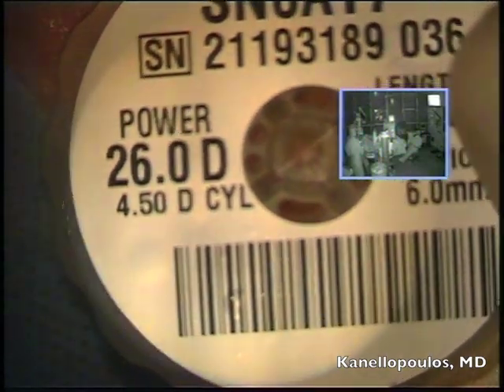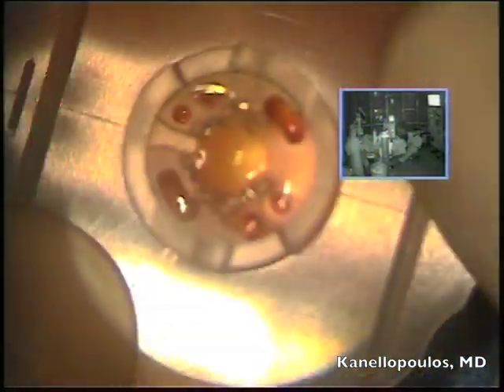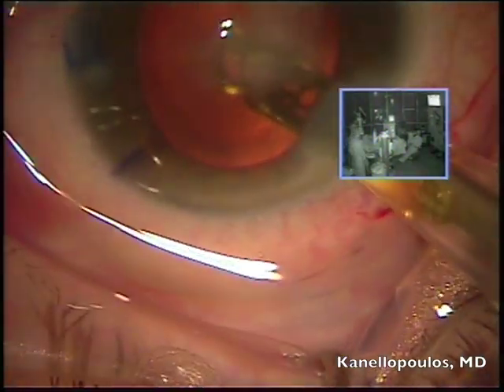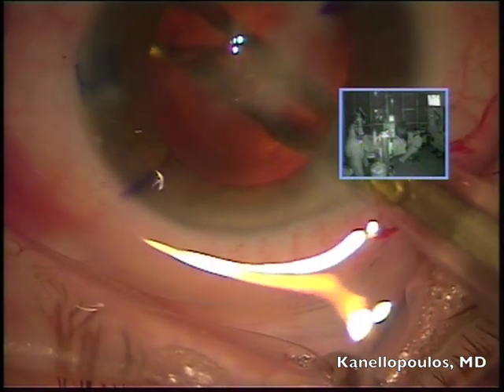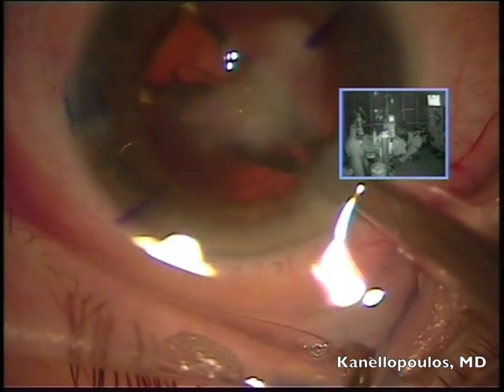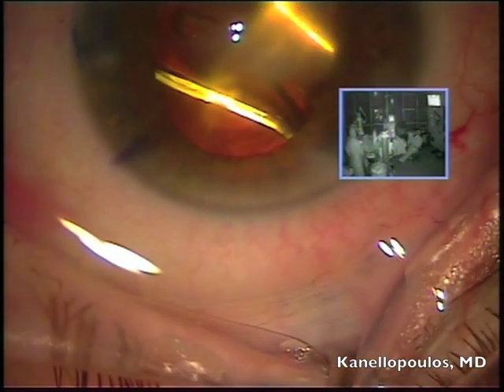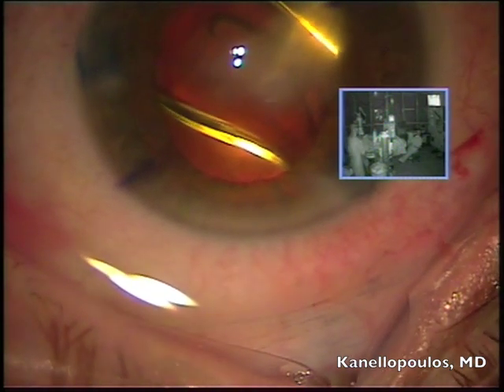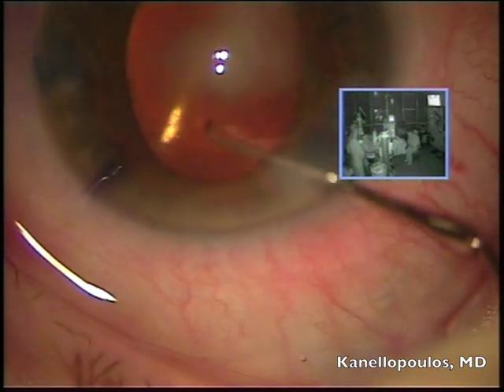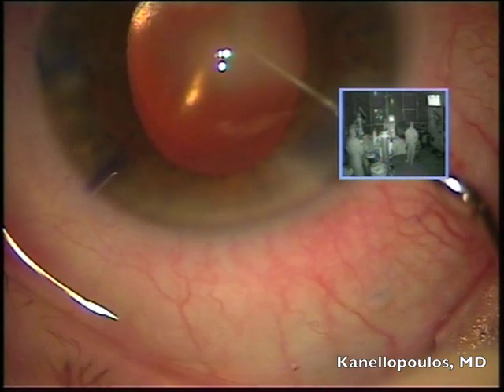Methylcellulose to fill the bag, and here is our T7 lens. Again, we use the ASCRS calculator to avoid a possible hyperopic surprise on the calculation of the lens in this patient, because the cornea topography resembles that of a cornea intervention to reduce myopia with a central flattening. Lens is in the bag, and the second challenging part of the procedure, actually the third, IOL calculation, is a challenge in these very irregular corneas. The second was the procedure itself. The third is to line up the lens markings.